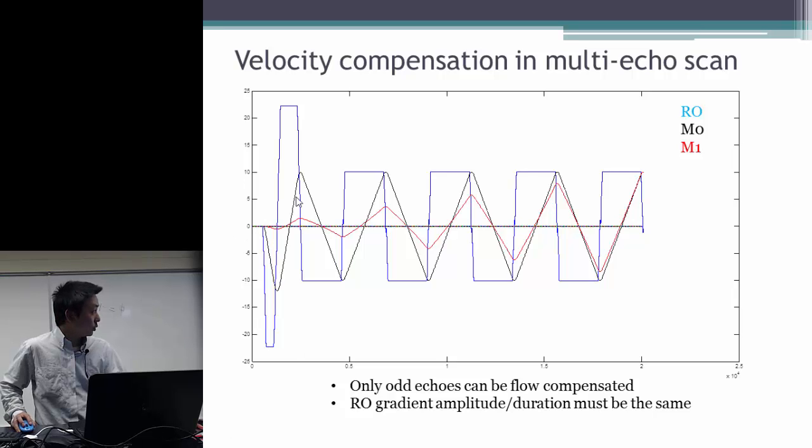And there is also one more condition for this to be true: we need to play out the readout gradients with the same amplitude and duration.